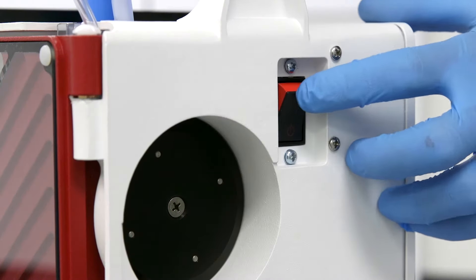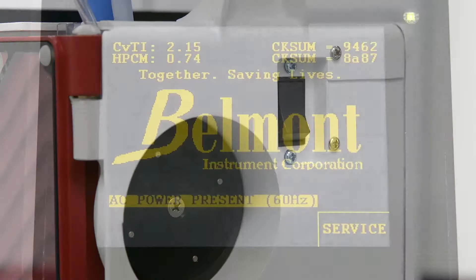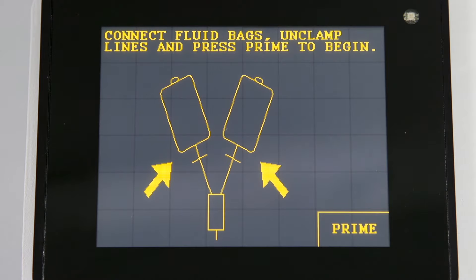Press the power button firmly to the on position, which is located on the back of the device. After a brief self-test, operation instructions will be displayed on the screen.